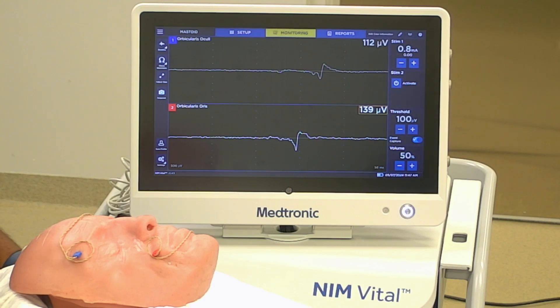This is the tap test that you should perform to verify that your recording electrodes are picking up activity. Once the electrodes are placed in the proper placement — so if we're doing an ear case, a mastoid, or anything with a facial nerve — we're placing electrodes above the eye in the orbicularis oculi, and we're placing electrodes in the orbicularis oris, as shown here.